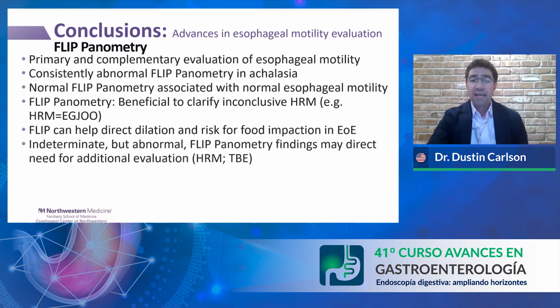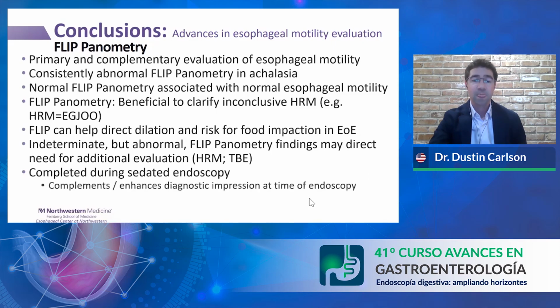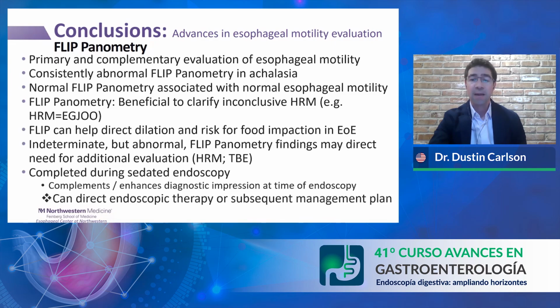Though also noting that indeterminate or inconclusive FLIP findings may occur, and that these may direct the need for additional evaluation with either manometry or barium esophagram. But overall, FLIP is completed during sedated endoscopy and thus is well tolerated by patients, and can also help complement and enhance the diagnostic impression provided at the time of sedated endoscopy, as well as can help direct endoscopic therapy or the subsequent management plan.